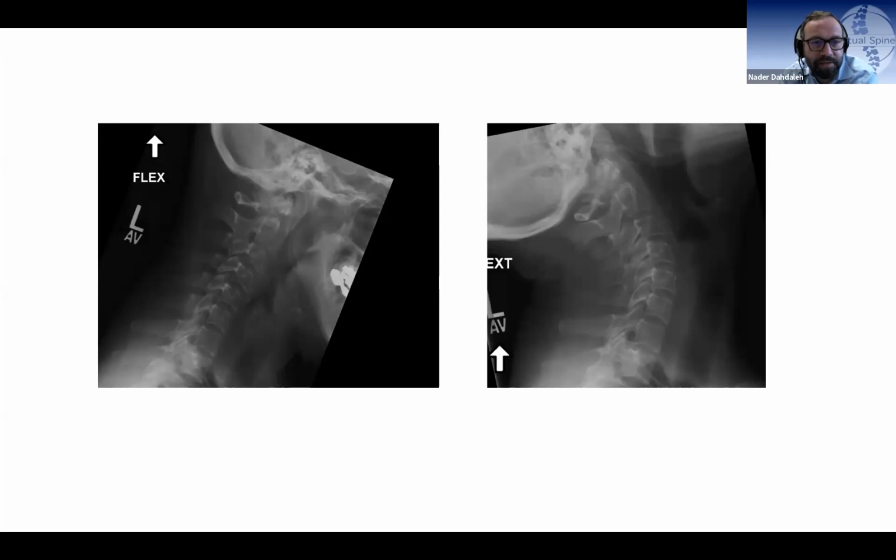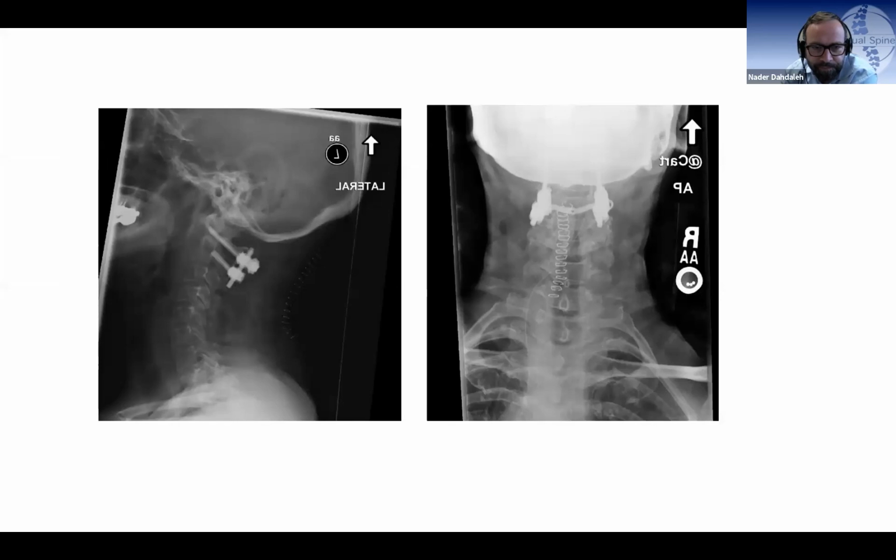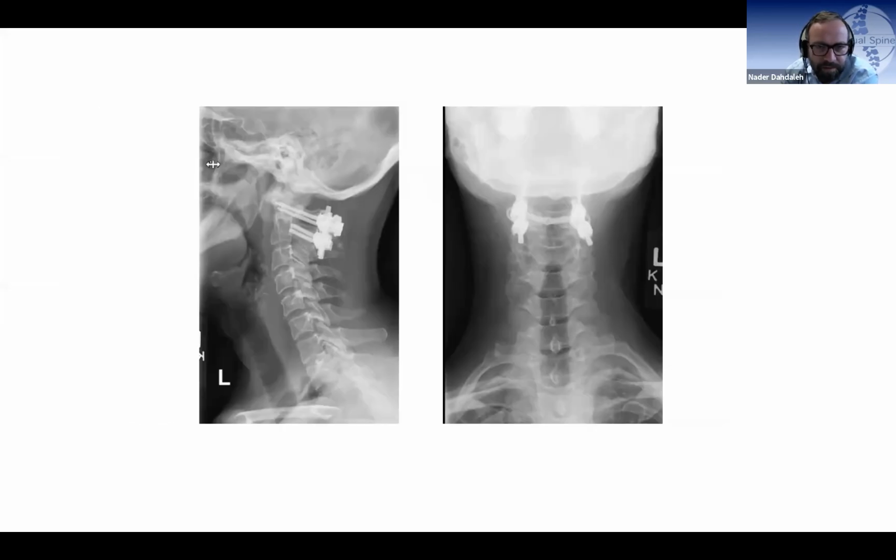Super smart, but that is 6 months after the injury. I mean, she's not protecting because of pain. That's 6 months after the injury, and she's definitely not comfortable and symptomatic from pain. But certainly she made an effort with this flexion extension X-ray, so she will be able to flex and extend well. Yeah, I get what you're saying. In the acute phase, they're guarding, but this is 6 months into the fracture, and she uses the brace, and still symptomatic.